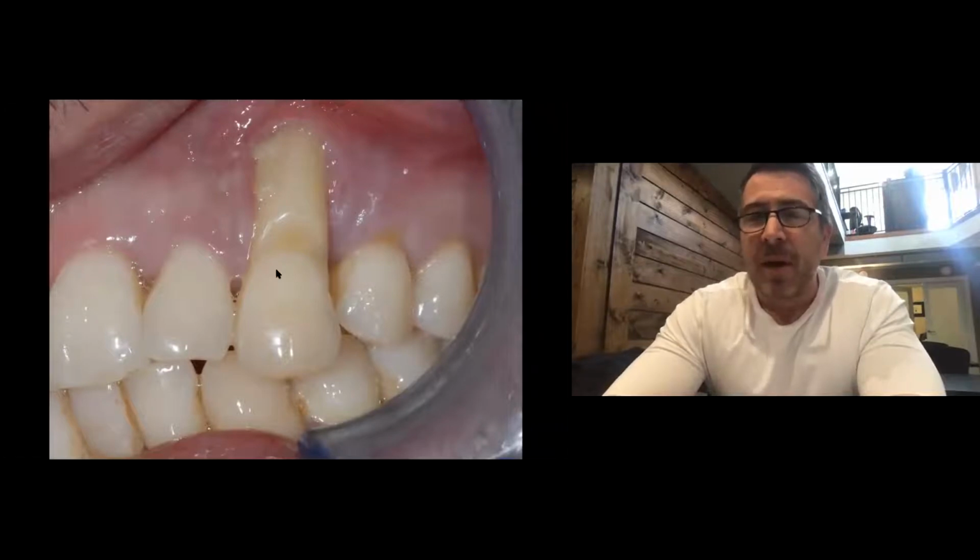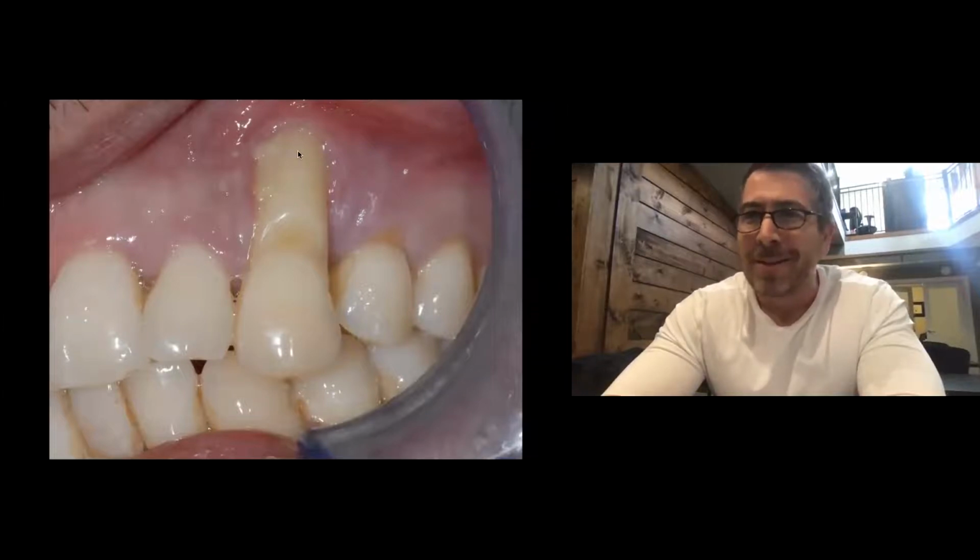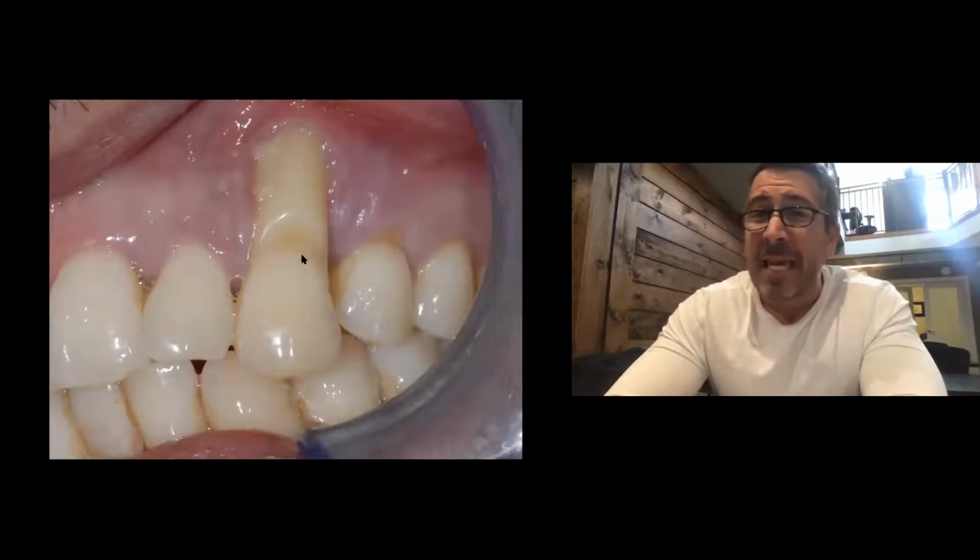So let's look at the two parameters we've talked about so far. Interdental height of bone to predict papillas, facial crestal height as far as predicting zenith. You should be able to look at this case and say, this is a problem with the zenith. You should be able to look at this case and say, is this or isn't this a problem with papillas? You don't know that. What do you need to do? What do you need to know that? You need to see the radiograph.